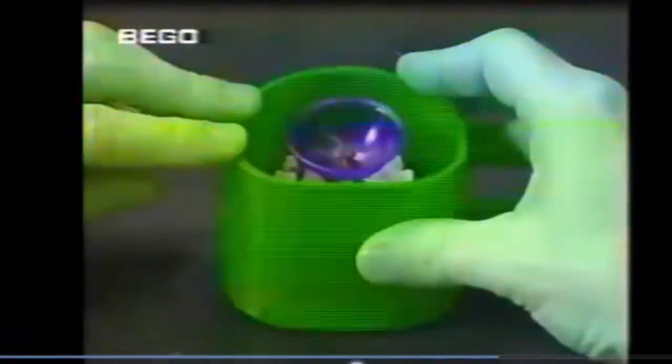When the mold ring is put on, it must be ensured that it fits on the base of the investment model or the base plate without any gaps. This prevents rising air bubbles being trapped between the dry model and the moist investment material. Investment material and mixing liquid are to be stored at about 20 degrees Celsius. A climatic chamber is a suitable means of achieving this, but a fridge converted to the temperature range required can also be used.